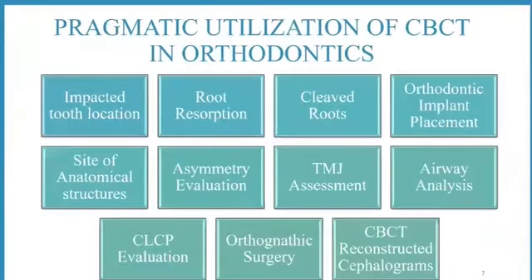So we as orthodontists not only deal with the alignment of the teeth, but also with maintaining the harmony between the facial bones, muscles, and the soft tissues. The conventional radiographic techniques hold us back by giving us a 2D image of a 3D facial structure. CBCT takes us a step forward in our day-to-day diagnosis and treatment planning, along with execution of a few complicated procedures. So I'll give you an example.